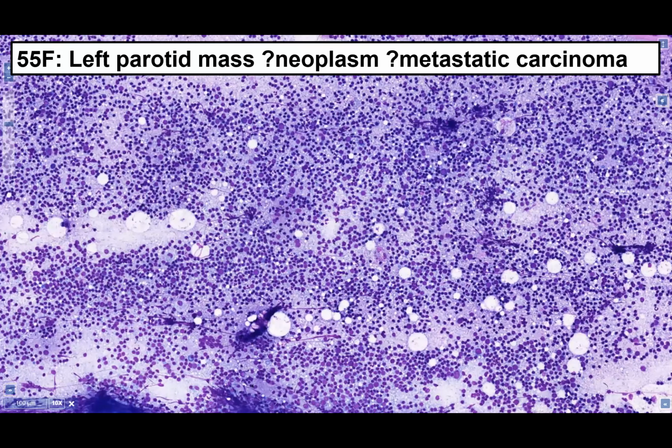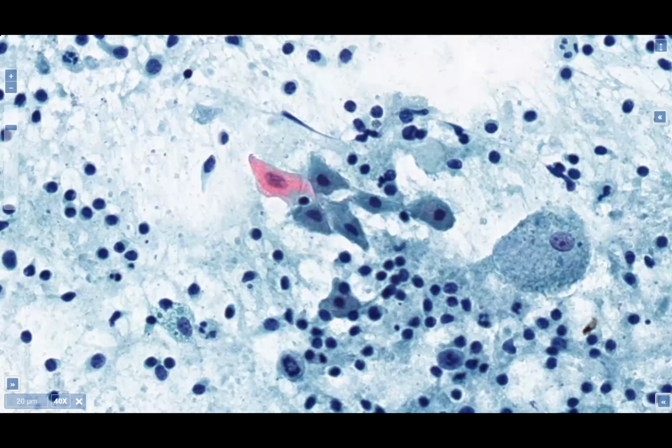So first case, if we look at this, a left parotid mass, query neoplasm and query metastatic carcinoma. This is in a 55-year-old female. We also know she's a smoker, and you can see here we've got a polymorphous population of lymphocytes. Not particularly any epithelioid cells we can see here. When we look on the PAP, we can see that there are these squamous cells, which some look like they have hyperchromatic nuclei, a little bit possibly irregular, but in the background of lots of lymphocytes and macrophages.